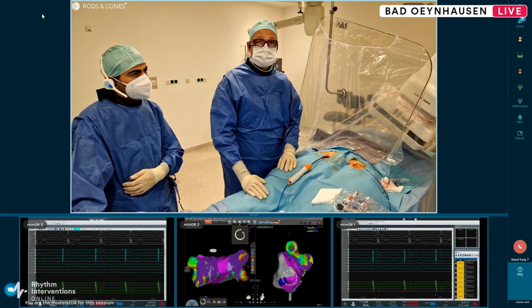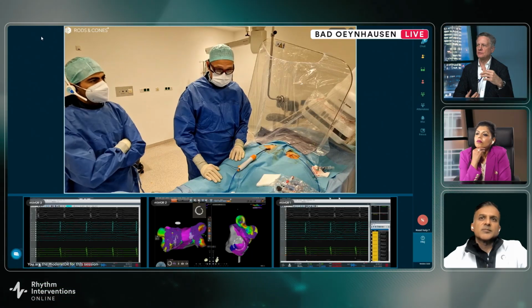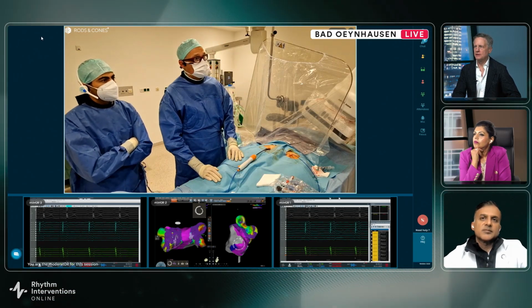But Christian, I'm really talking more about patients you've brought back because they've had a recurrence and you're having to redo the procedure. So bringing them back on another day, what's your approach then to?